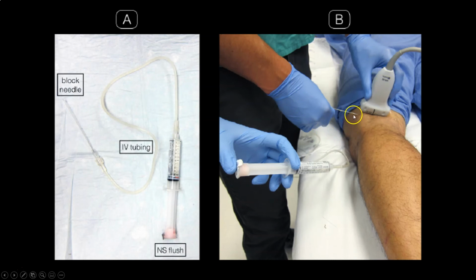Remember, a pointy object should always go in the hand that's better equipped to deal with it. And then the second operator has the syringe back here with some saline that they can flush through, and then they filled it up with whatever agent they're going to use to block it.